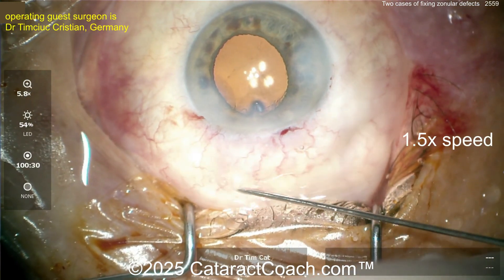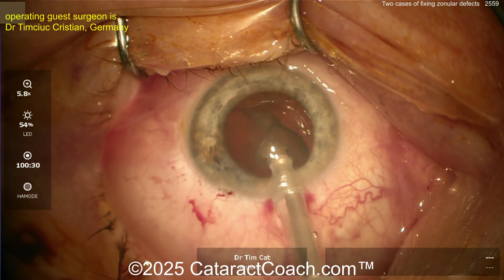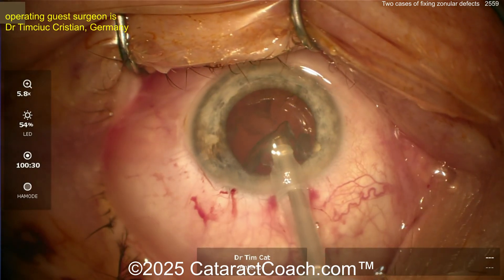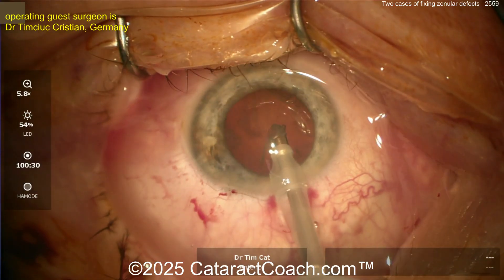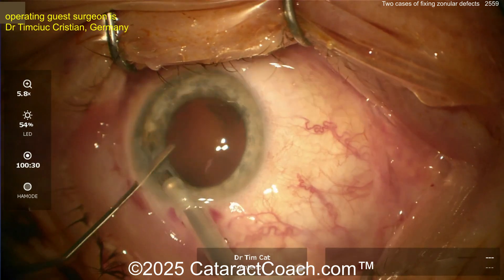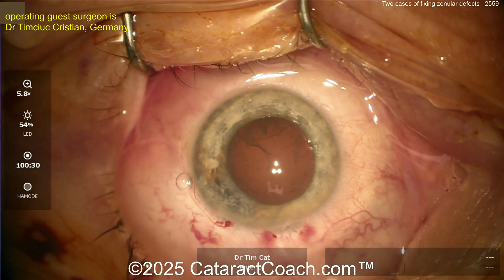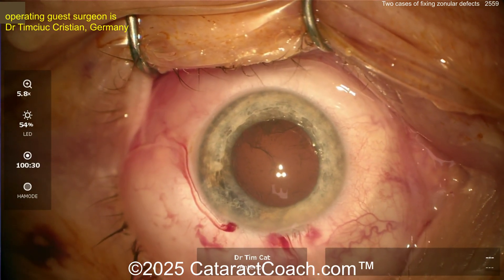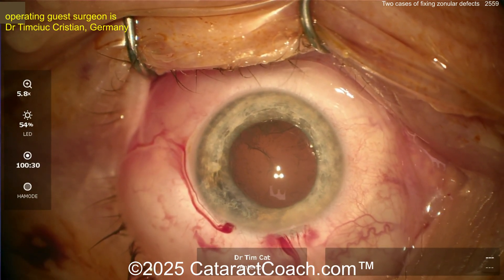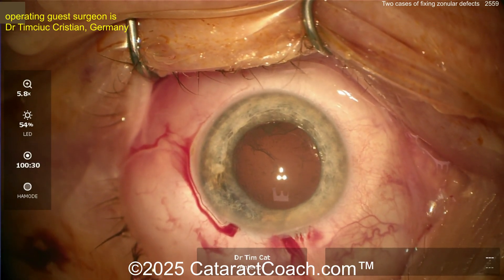Now I'm going to show you another case from the same very talented surgeon to show issues with dealing with zonular weakness. Taking out the lens here — looks all pretty routine; nucleus comes out pretty easily. Going inside with a spatula in one hand — that last little piece — good. Again, seems like a pretty routine case; let's see the cortex removal.